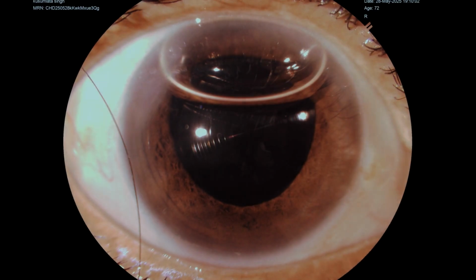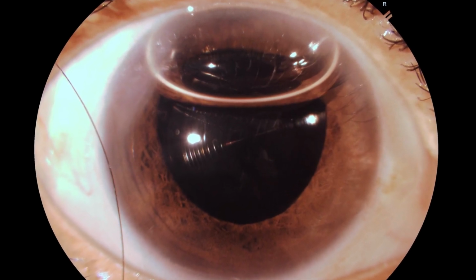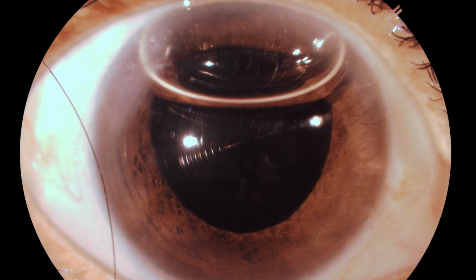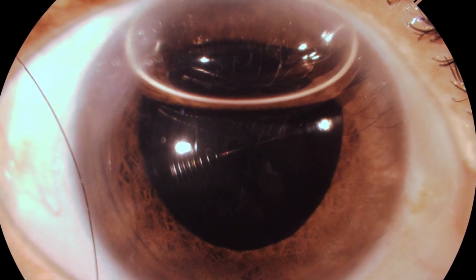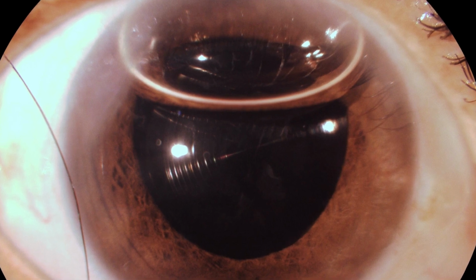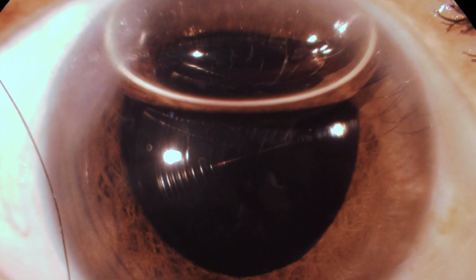So after doing all this, we can see the next day picture shows an air bubble, the cornea clear, which indicates that intraocular pressure is normal, and also the PCIOL is well centered. The patient's vision at this moment was 6 by 18 and 6 by 12 BCVA.